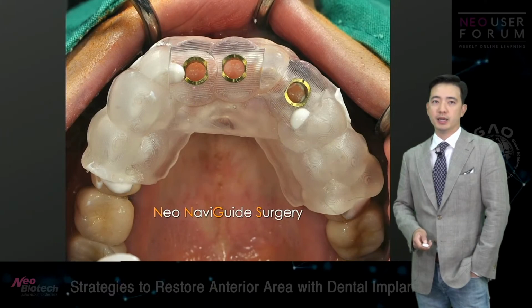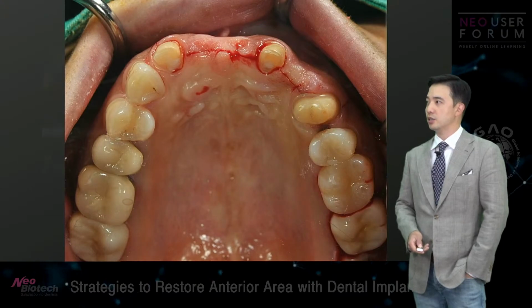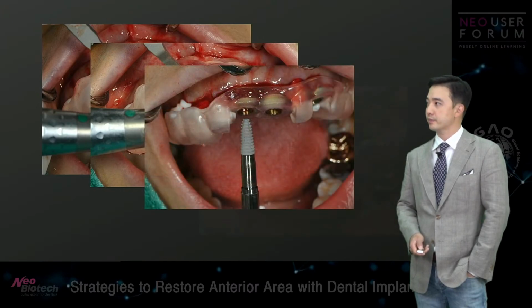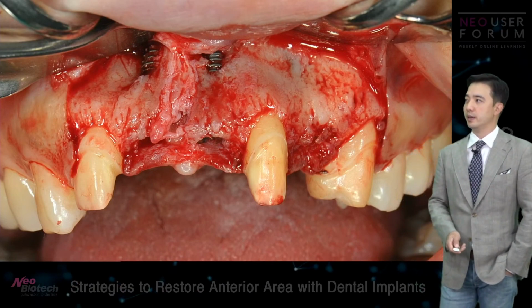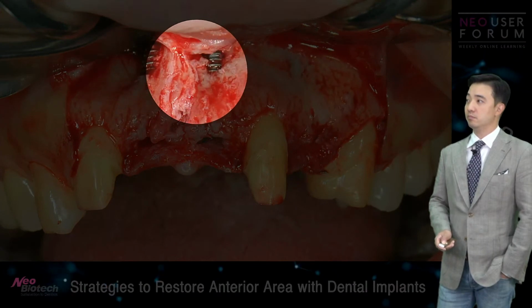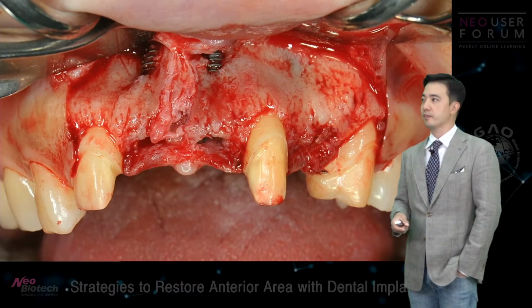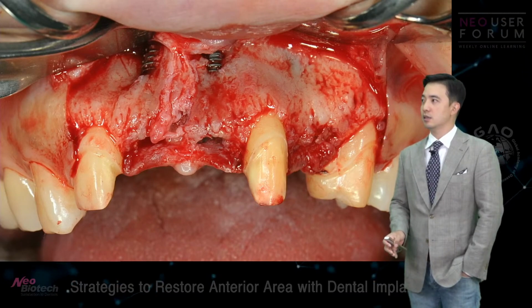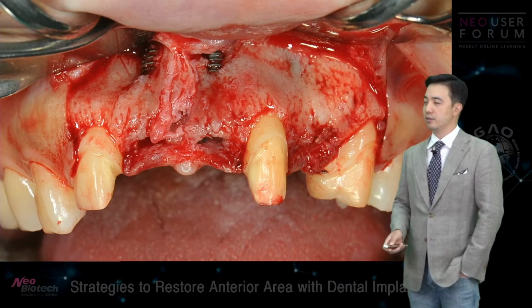We went in, marked the implant position, made an incision, did guided surgery and everything. Implants went in, and this is how I opened the flap. As you look at here, as we planned the implant, the apex just came out of the alveolar bone, and I didn't really get surprised or anything, because I knew the implants were going to come out this way.